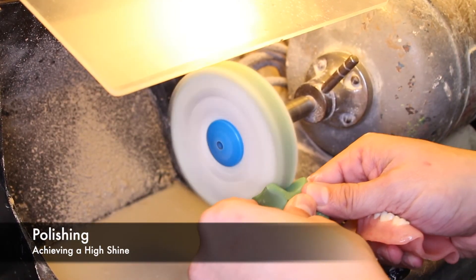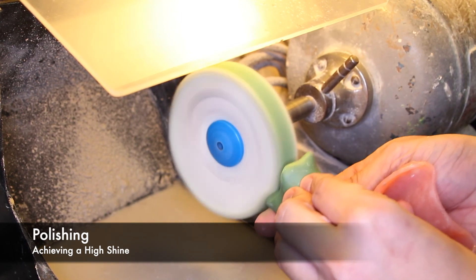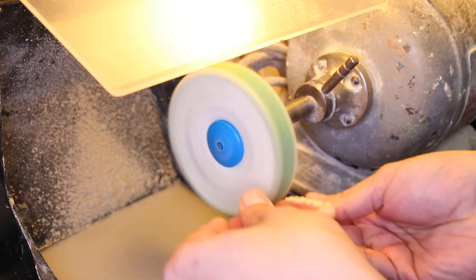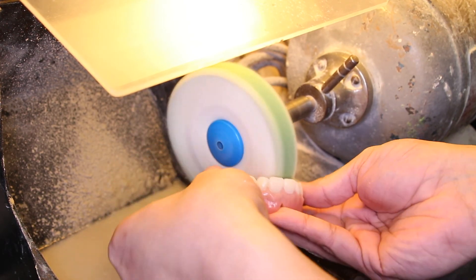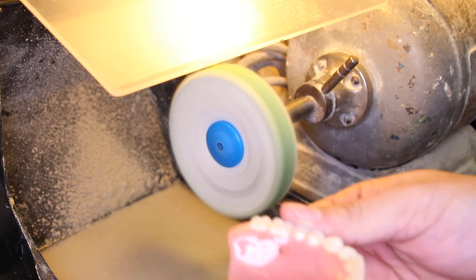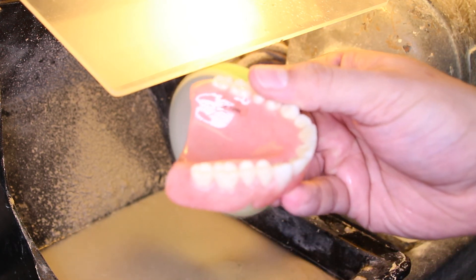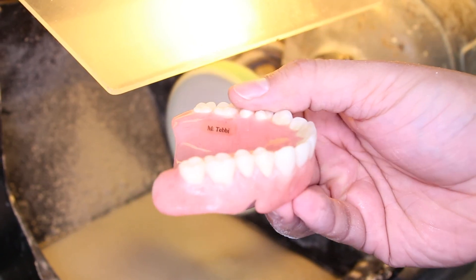After smoothing the area with pumice, the last step is to polish. This will achieve a high luster. A polishing compound is first applied to the rag wheel, and then from the rag wheel applied to the denture. After a few rotations, you can see the ID tag area is now fully polished with a high luster, and the name is legible.